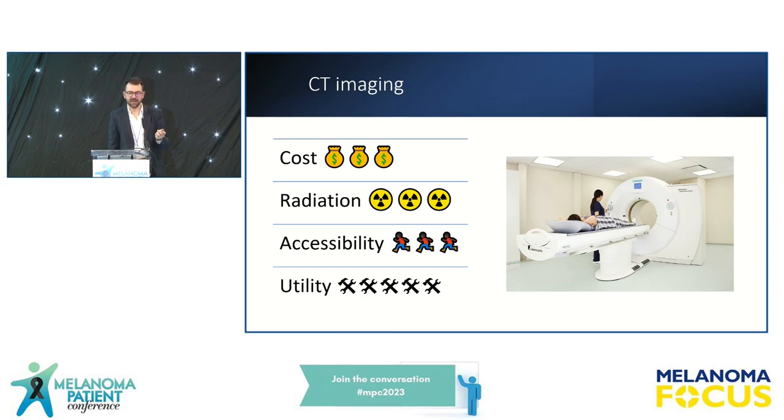So ultrasound is best used when there's a very specific question. For example, in a patient who's had groin surgery, Howard might send me a patient asking if it's scar tissue that they can feel in the groin, or if there's any lymph nodes there that we need to pay more attention to, or if a patient's noticed a lump in their groin or under the armpit, then that can be very useful to assess with ultrasound. And again, we can pop a needle in if needs be.